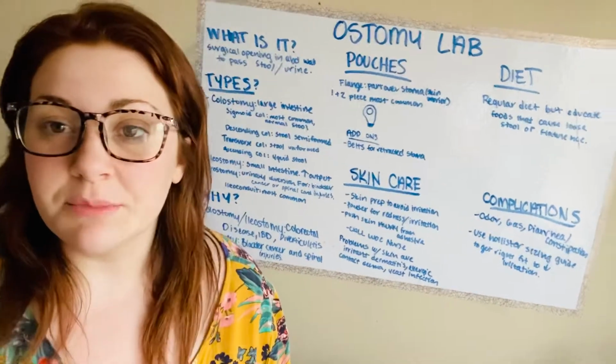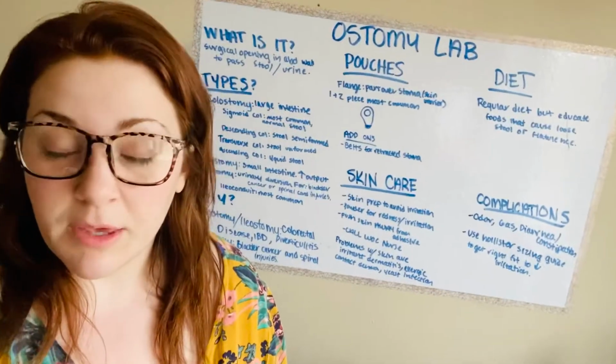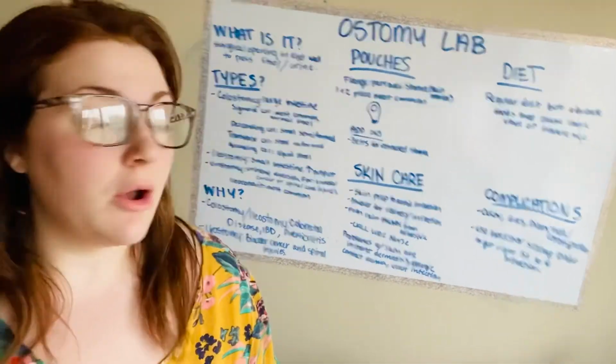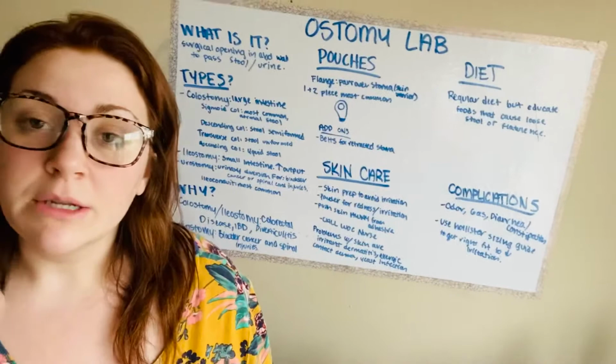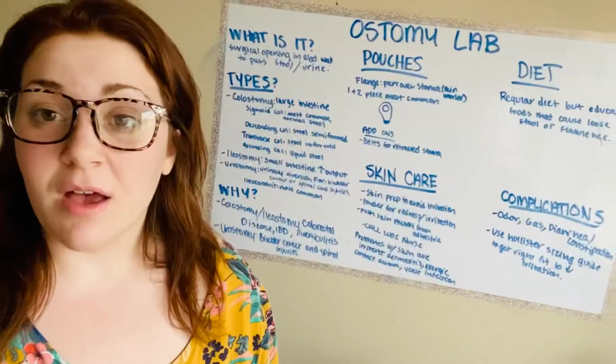All right, so I'm going to attempt to do the ostomy lab in 5 minutes or less. So what is an ostomy? It is a surgically created opening in the abdominal wall to pass urine or feces. So what are the different types of ostomies?